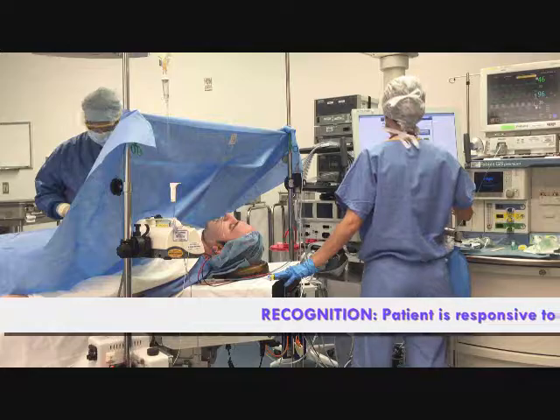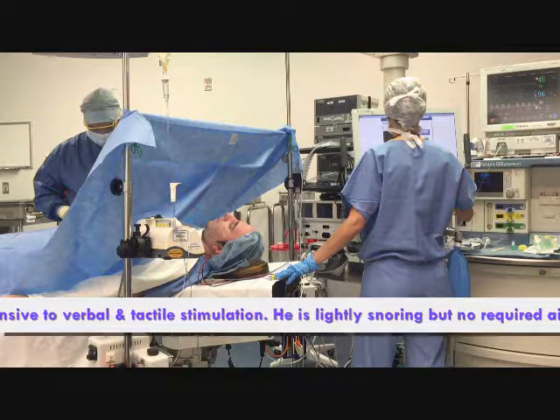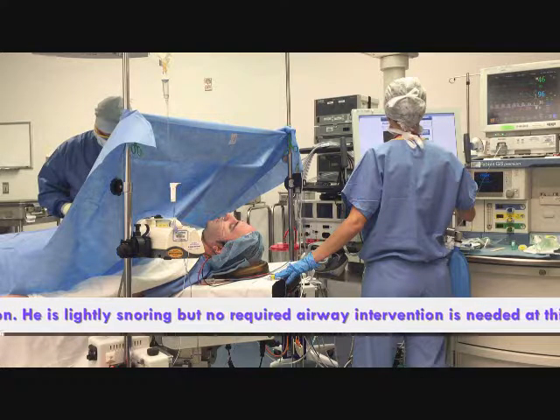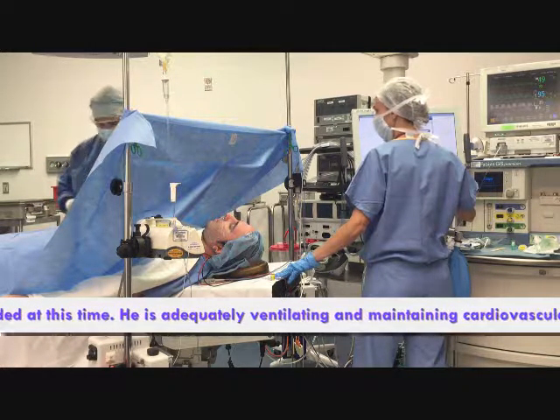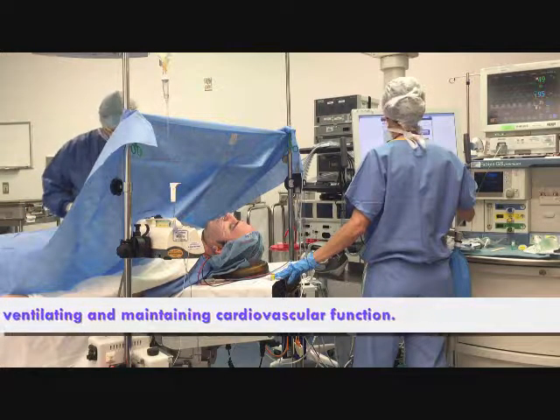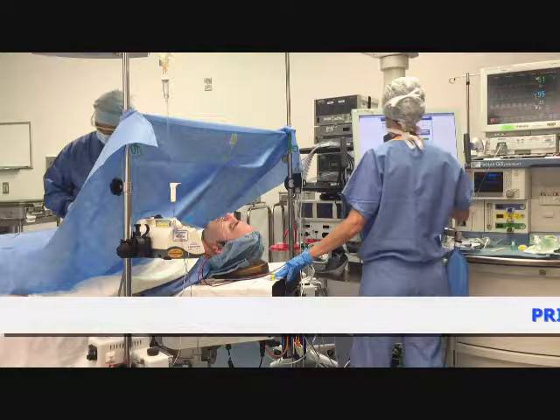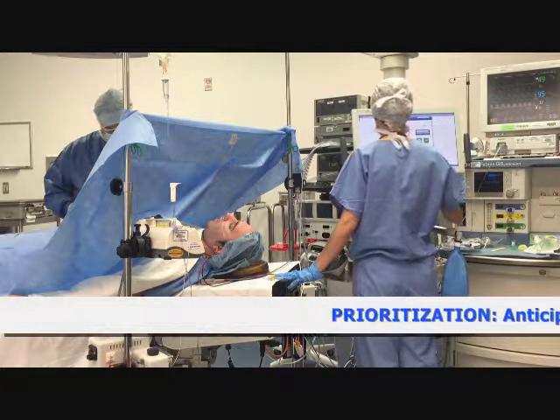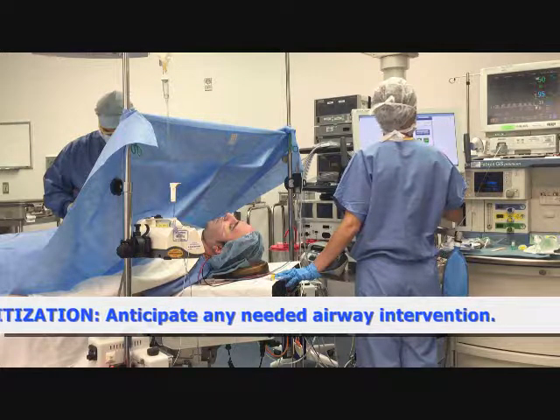Recognition. Patient's responsiveness is purposeful to verbal and tactile stimulation. Lightly snoring, but no airway intervention is needed at this time. He is adequately ventilating and maintaining cardiac function at this moment. Sedation level is providing optimal surgical conditions at this time. Your prioritization is to anticipate any needed airway intervention.